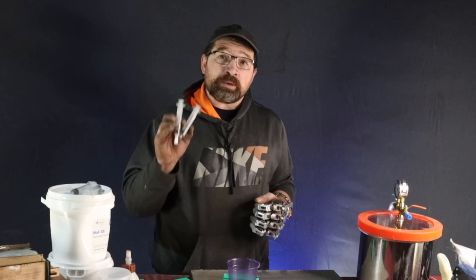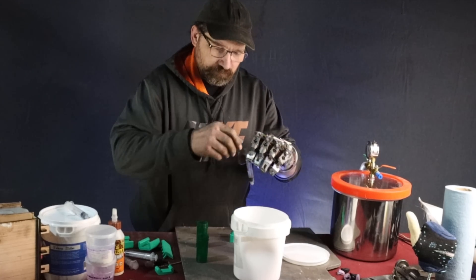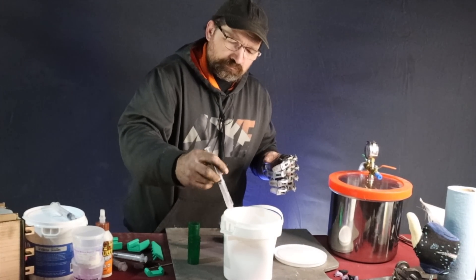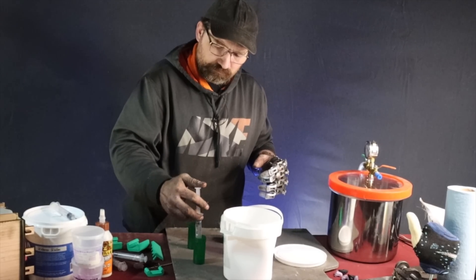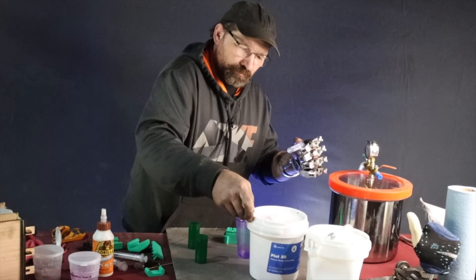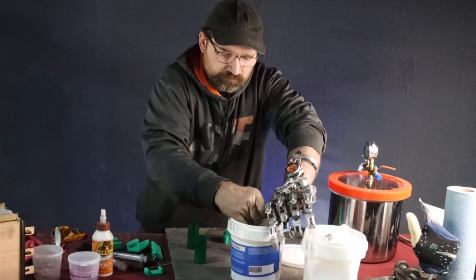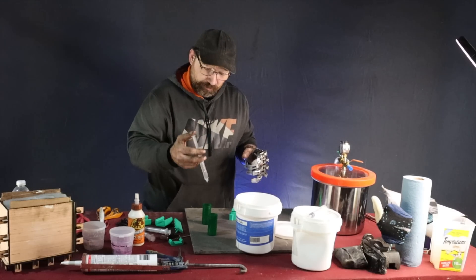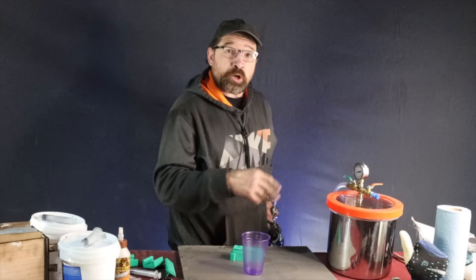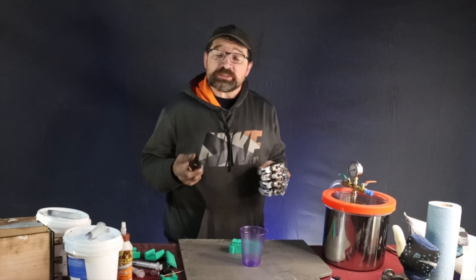Since we're making such small batches, I metered out with a couple of 10-milliliter syringes. Start with Part B and move on to Part A. Be sure to put it in the other pill container and be sure not to use your A syringe in your Part B silicone. Go ahead and put them in your degas pot and pull a vacuum. Since they aren't mixed, you can cycle this several times to be sure to get as much air out as you can.